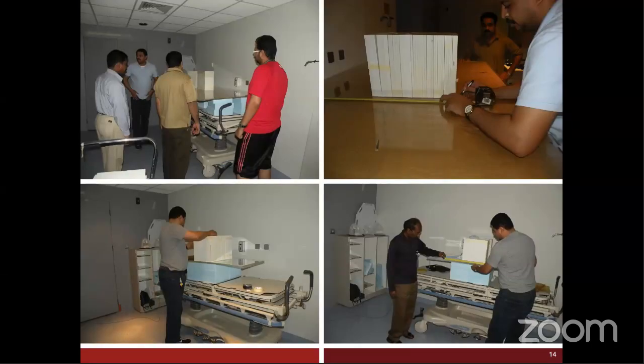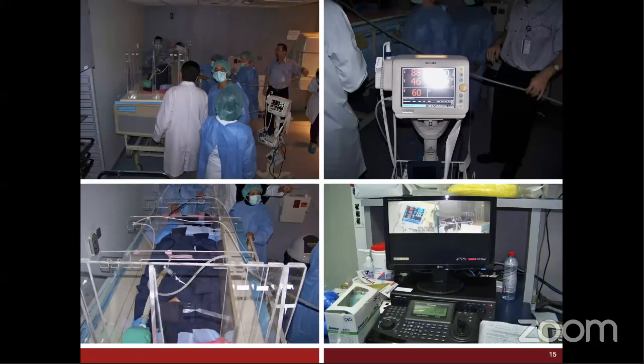So this is how we commissioned our TBI. That was done in 2011. Here is Dr. Ganesh. He was a great help in doing this job. And eventually, we established this technique where the patient is placed in a box, and we fill this box with rice bags.